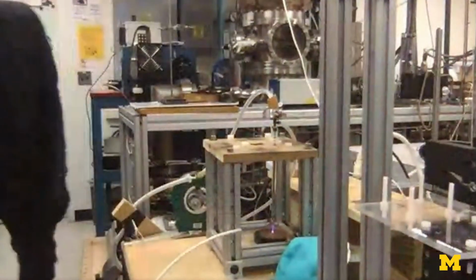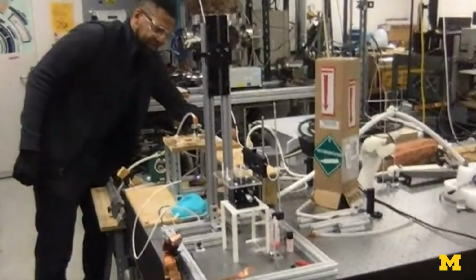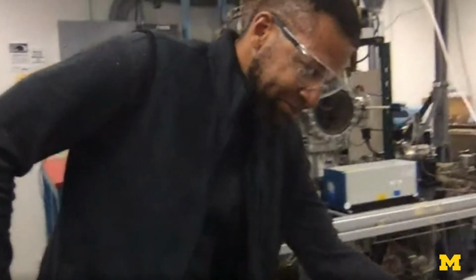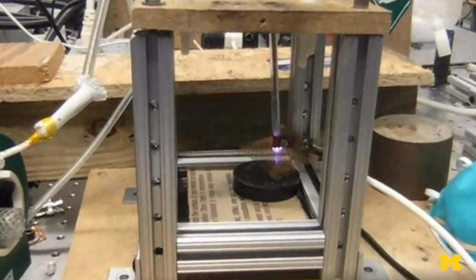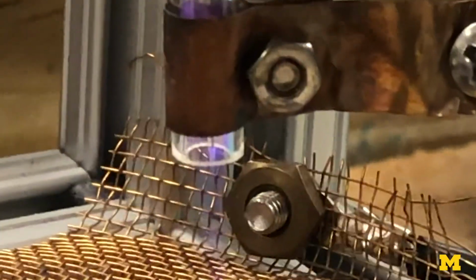The reactivity in that fluid gas is so highly reactive, you need only seconds of contact between plasma and the surface. Initial results have been promising, and Foster and Gamba hope that the portability and scalability of the process will enable future use in hospitals and beyond with a wand-like device.